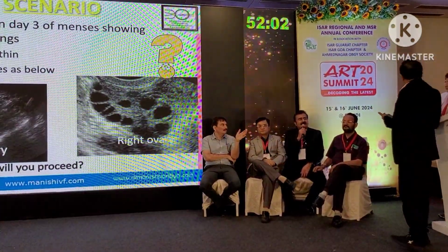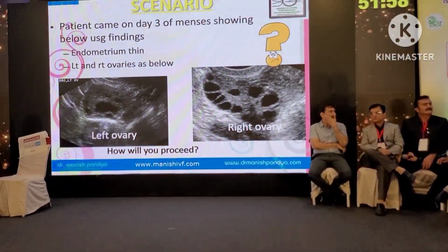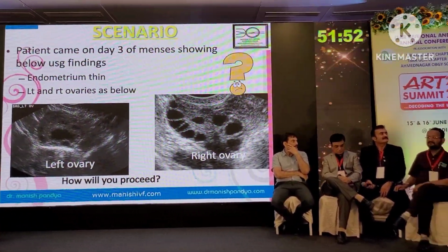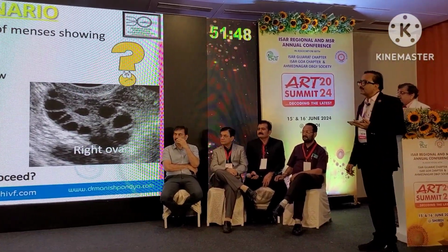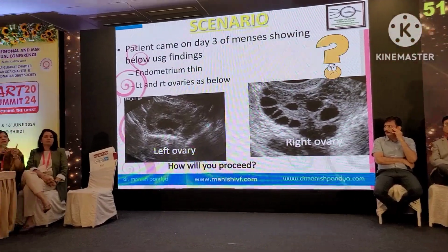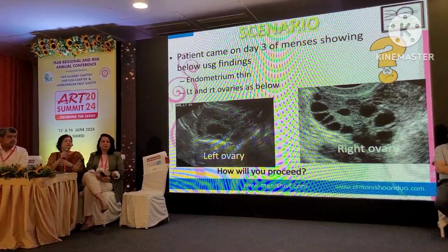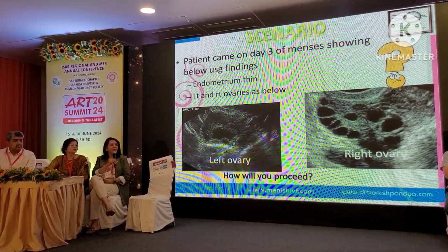And now there is another point. If you see a follicle that may not have the right size, but still you find there is adequate flow, what do you opine on this? Anybody can opine on this? The size is there for the endometrium also at that point. Yes, that will also guide us, because if it's a thin endometrium, single line, then you are sure that it's a non-functioning follicle. Very good, fantastic. You don't have to subject the patient to unnecessary estrogen levels and all. And I think TVS also helps with the.